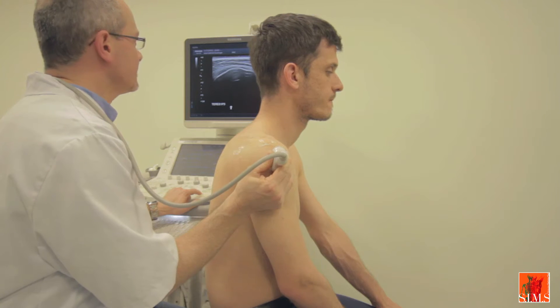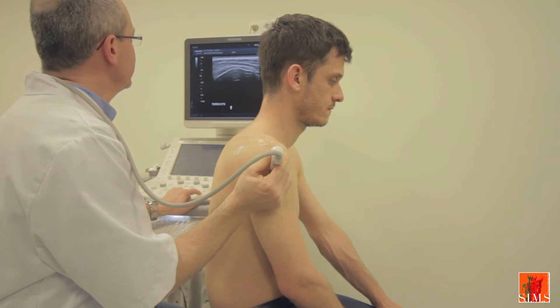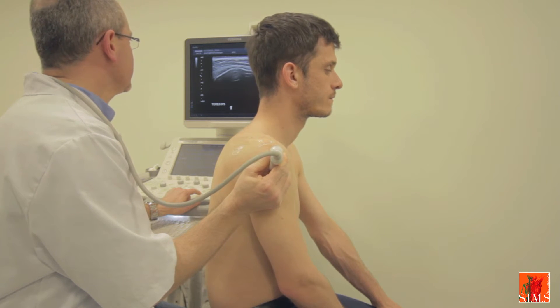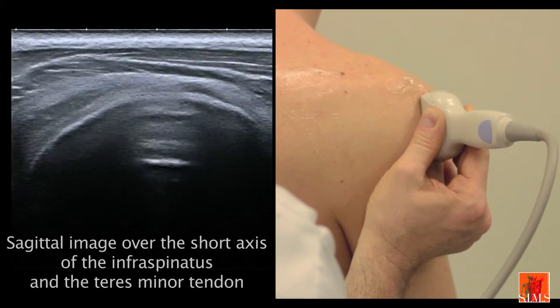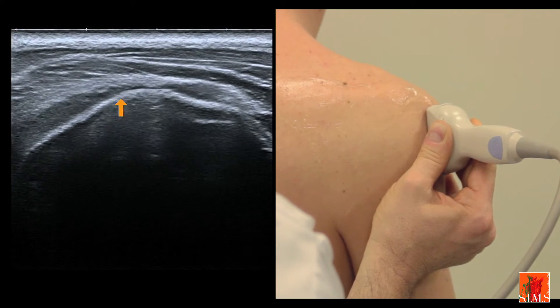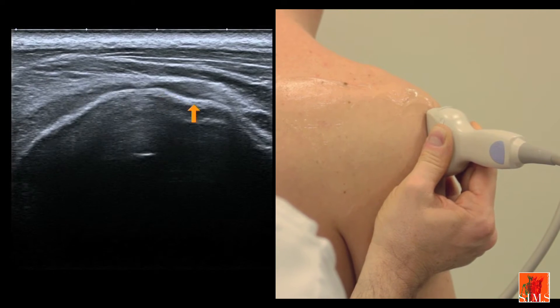We will complete the exploration of the posterior region by an analysis of the teres minor and of its relations with the infraspinatus. On this very lateral sagittal image, we can rather easily evidence the oblique facet of the greater tubercle on which the infraspinatus inserts, and its vertical insertion facet on which the teres minor inserts.